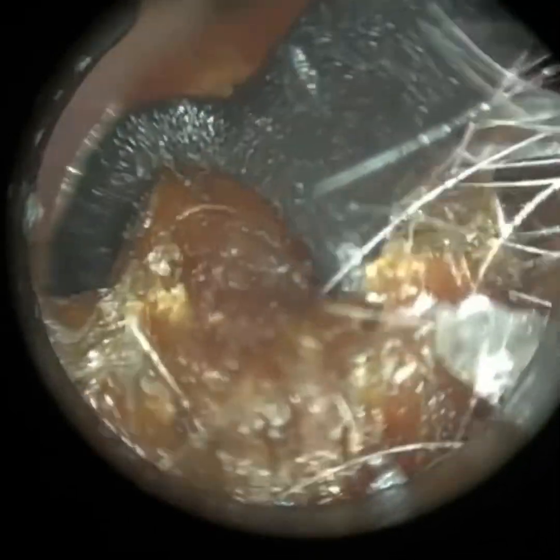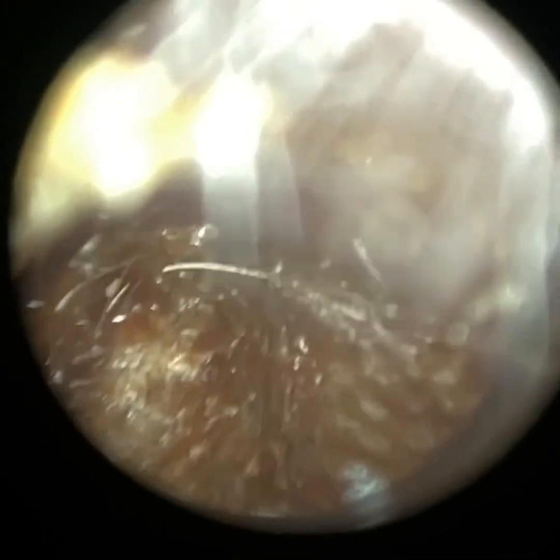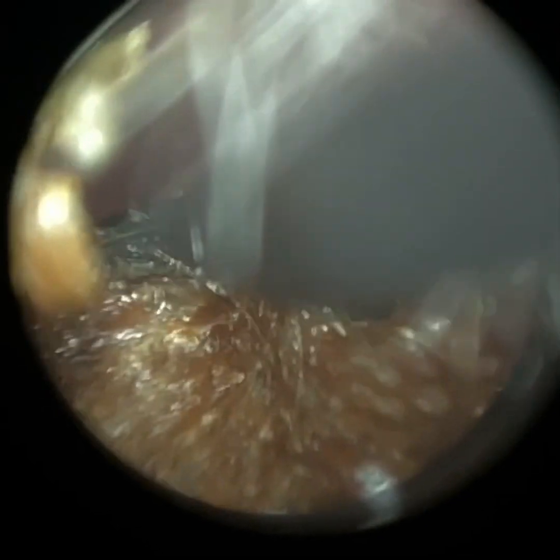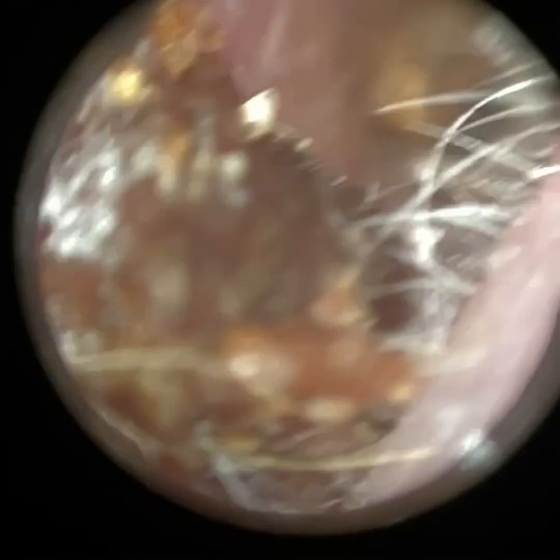I'm just slowly bringing this forward. It's a bit soft at this section, so it's breaking up into smaller bits. When it's soft, sometimes when you're using a corette you can almost spread it like butter against the canal wall, which we want to avoid. So I'm going a bit deeper — you can see there's an opening there — and I'm just going to leverage in and behind. If it were a bit firmer, when I started to leverage it would have brought the whole piece out, but instead it just sliced the section away. I think I'm going to go back to suction here just to lift it off the canal, because during the procedure I felt I was compressing and spreading it against the floor of the ear canal, so I just want to mobilize this section.